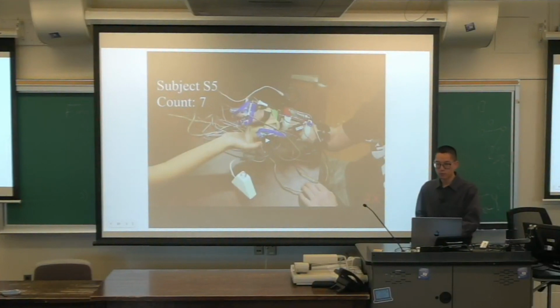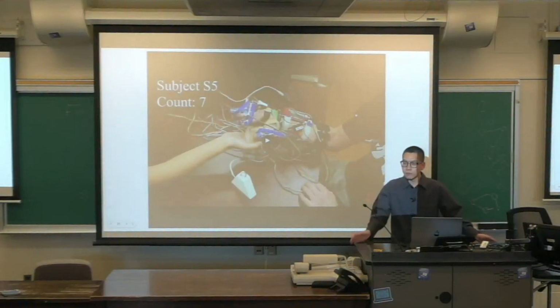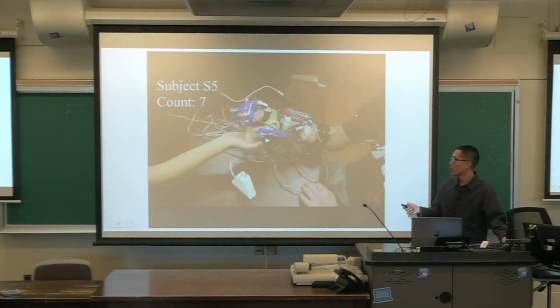Okay, so yeah, question. Is it learning while inferencing? Like during testing, is it learning at that time as well? Yeah. So this is our algorithm on the fly, on the device. We collect the initial data set following the same protocol, and then we start to use the device. And as the patient is using the device, the algorithm is still updating itself with the unlabeled data.